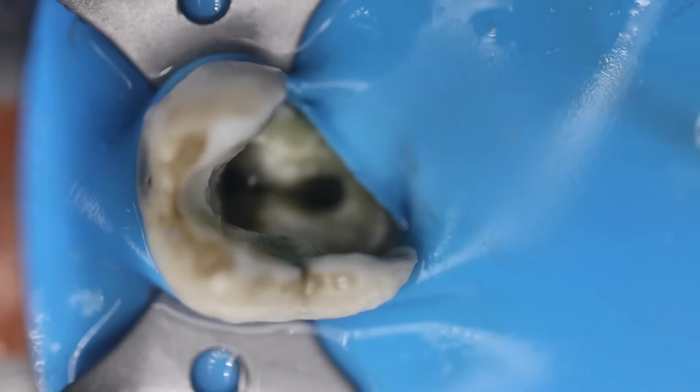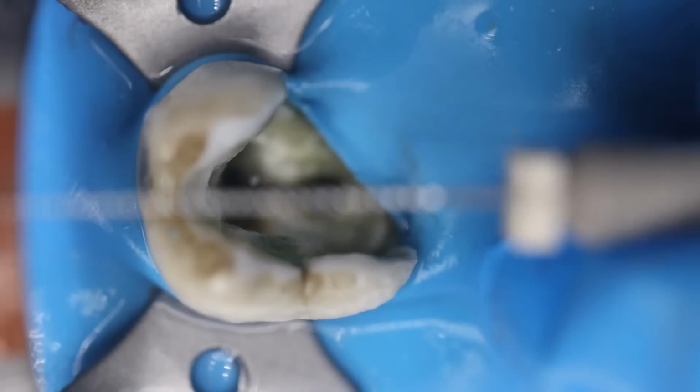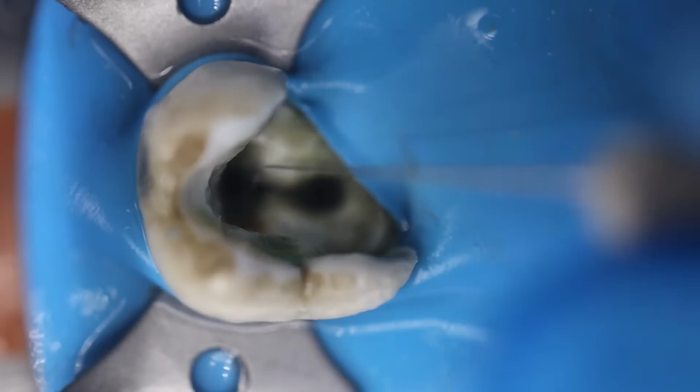Now, once you are done with the access opening, do one more thing before you go into the further process of biomechanical preparation. Take an 8K file or a 10K file just to initially negotiate the canals. We engage it into the orifice and see that the files are going in the right direction in the mesial or mesiobuccal canal.